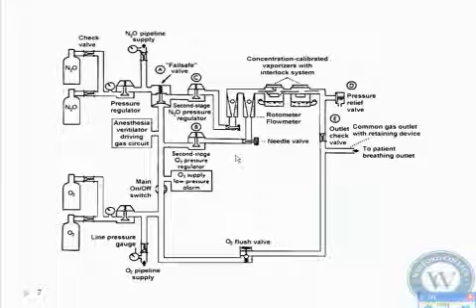Because these components here can break. They're made out of glass. They could crack. Anything could happen to them. And you want oxygen to be nearest the patient all the time. If you were to get a crack, if this were oxygen here, and you were to get a crack in this system here, then the oxygen is going to come and shoot out.